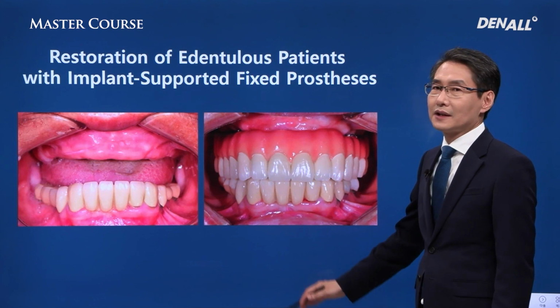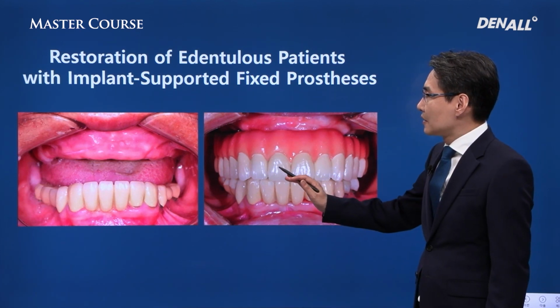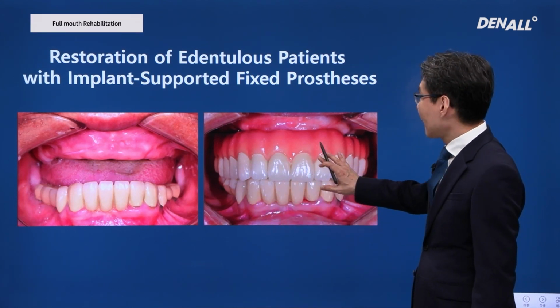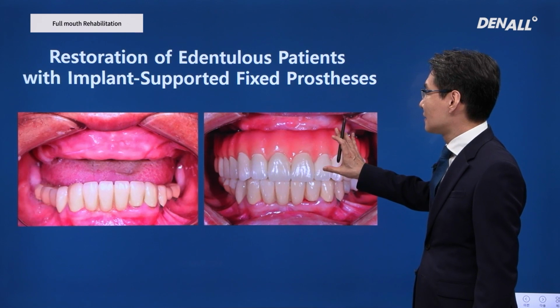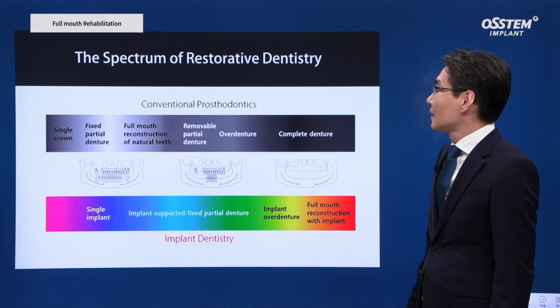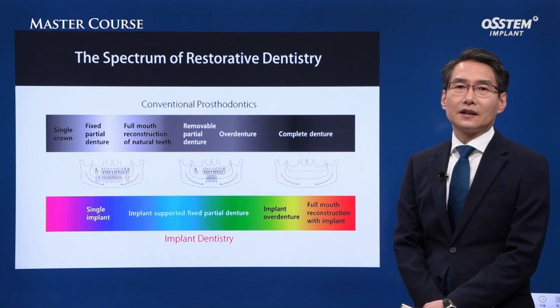With increased life expectancy, there are more and more fully edentulous patients. There are many ways to restore fully edentulous cases. Today I want to talk about the restoration of edentulous patients with implant-supported fixed prosthesis.